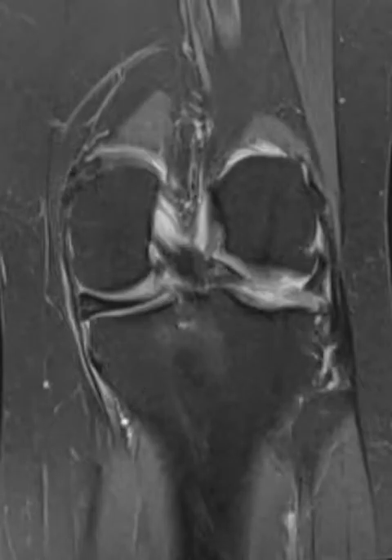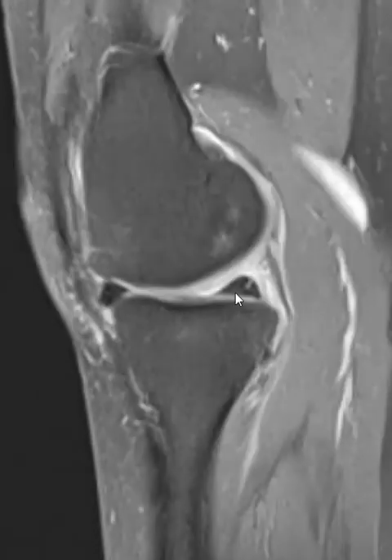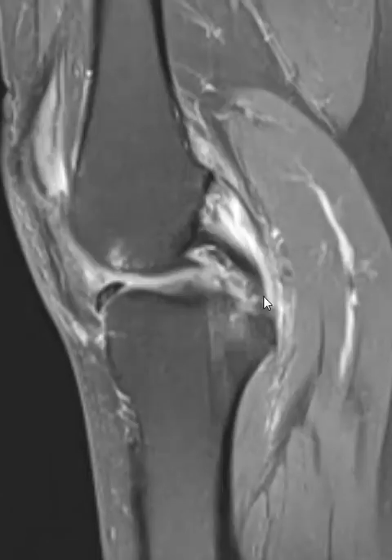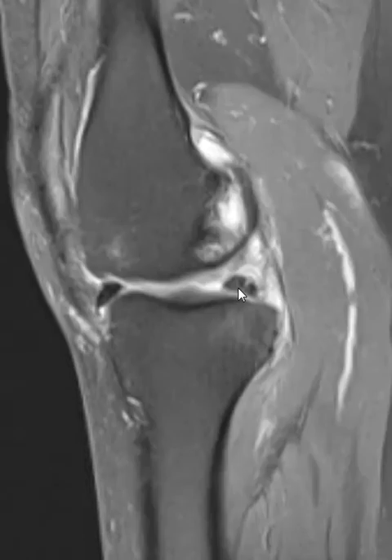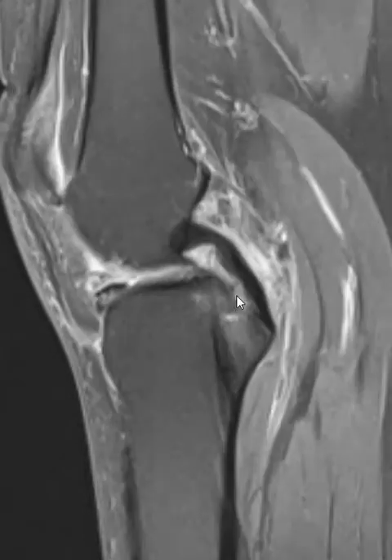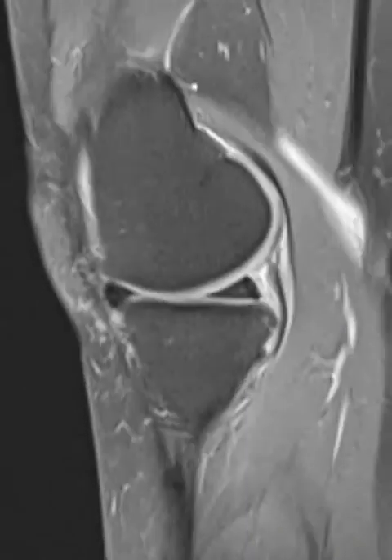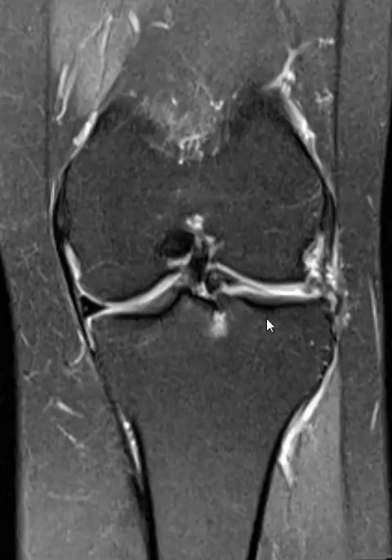If we put up a sagittal view, the medial meniscus looks pretty good. There's the posterior horn, a little funny thing out here in the back. And then right here, we see this gap. That's the radial tear. There's a gap within it. Again, it's separated from the bone. This is the bony attachment right over here. It should fit right underneath here. So radial tear of the medial meniscus root, and then a complex, large bucket handle tear of the lateral meniscus.